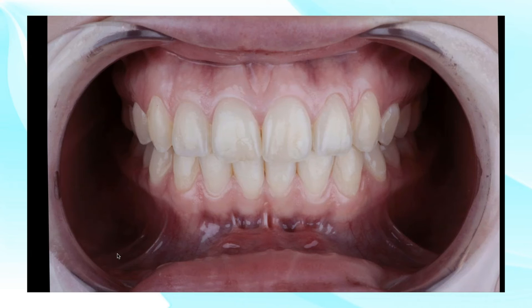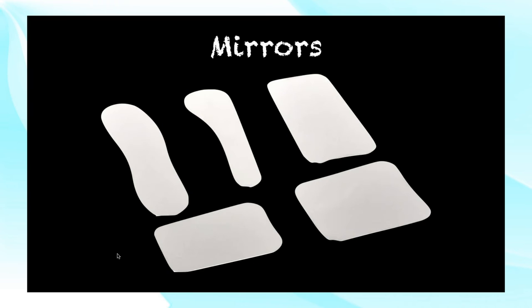In order to take a photograph like this one, we want to put those cheek retractors in, pull the cheeks out of the way, and make sure that we see everything in focus. We want to see everything well exposed. But if we don't have these tools, we're not going to be able to do that. The next is going to be the mirrors. Not all mirrors are created equal.